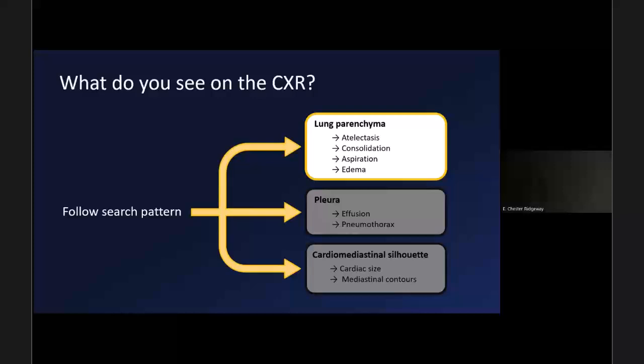Yes. It does. So like exposure time, et cetera, gets adjusted. So most of our X-ray machines now, if not all of them, the exception would be if the hospital happens to have some incredibly old X-ray machines lying around, but most of these machines have automatic exposure controls. So they automatically detect how much tissue is in front of them and will adjust as much as they can for it. But as I'm sure you guys have seen in your clinical practice, there are some times when we can only adjust so much. So, but yes, that was a good question though.